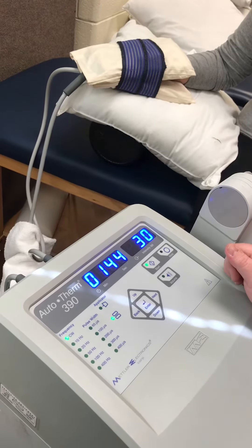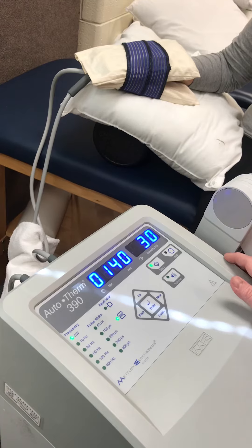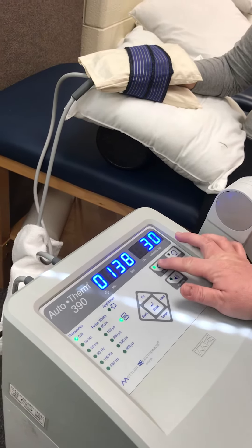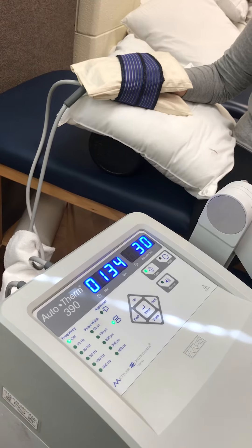You feel anything? Getting warm? Getting warm. Is it? Yeah. Okay. Doing all right? Yep. Okay. Sounds good.